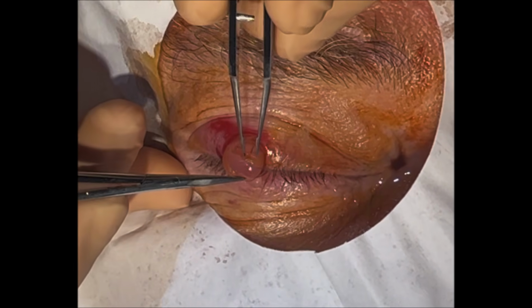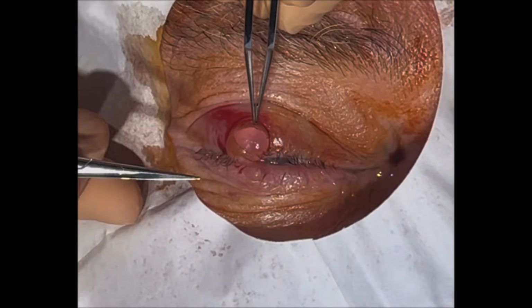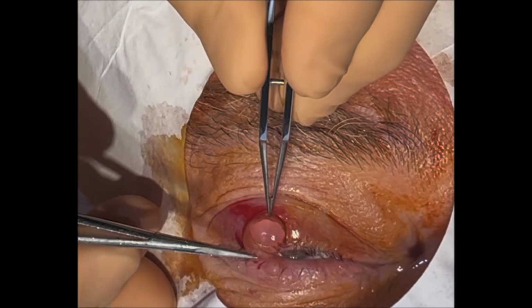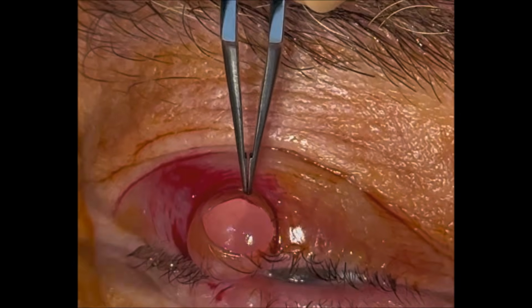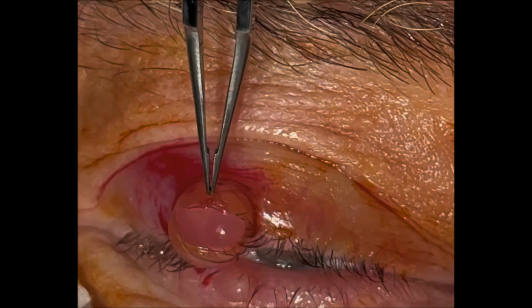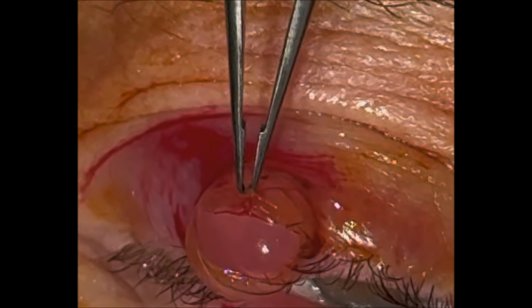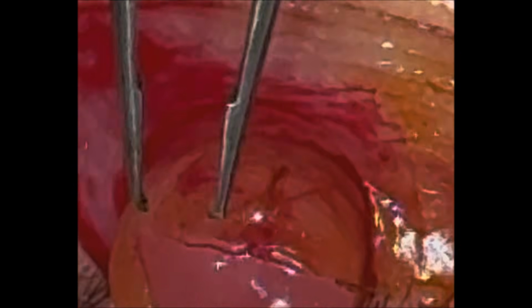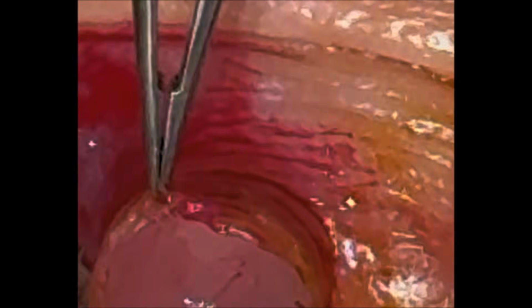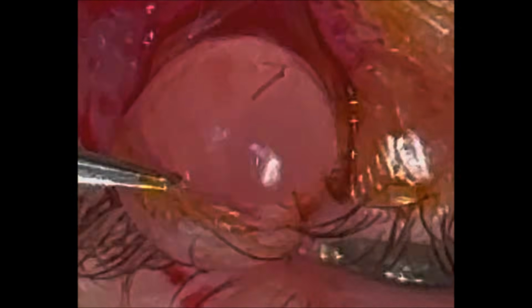Again, a lot of these cysts, the capsule is not that thick, and so it tends to burst pretty easily, but I'm trying to make sure I don't puncture the cyst and hold it completely so that it doesn't come out. You saw that little hair in the cyst. You can see that hair right there, right in that cyst material. Again, I do believe that is the nidus that's caused the cyst to grow in the first place.